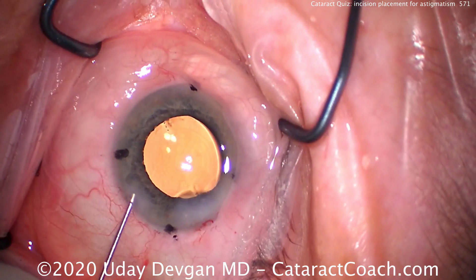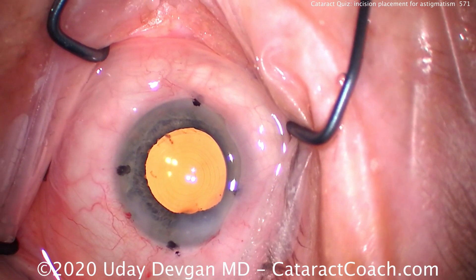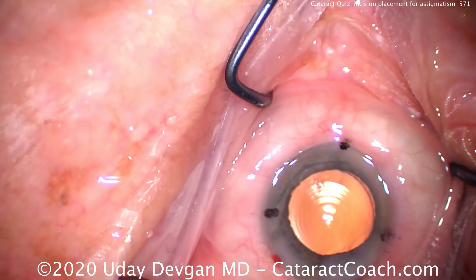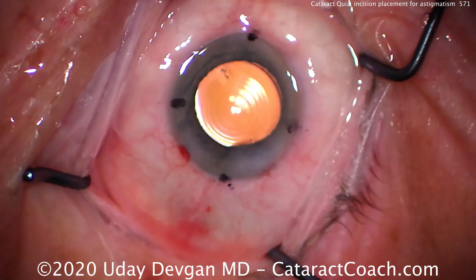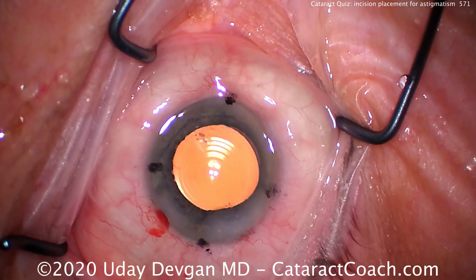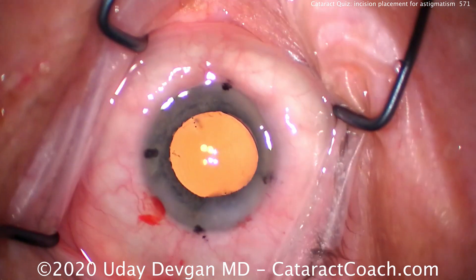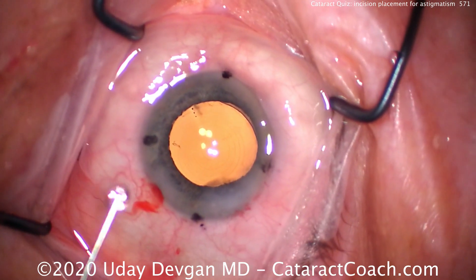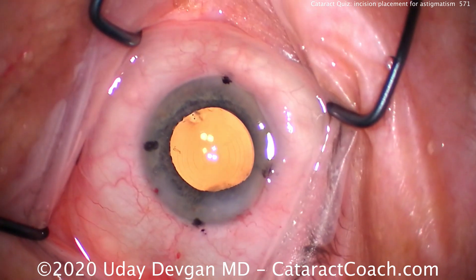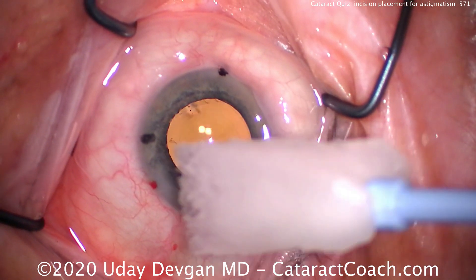Here's the lens — the dots on the lens are the toric markings. We're lining up those toric marks on the lens with the toric marks we made on the cornea at that 30 degree meridian, and you can see the lens is beautifully lined up. We'll confirm here at the end using the Purkinje images of the lights in the center of this multifocal lens, and then confirm the lens is lined up at the correct axis.